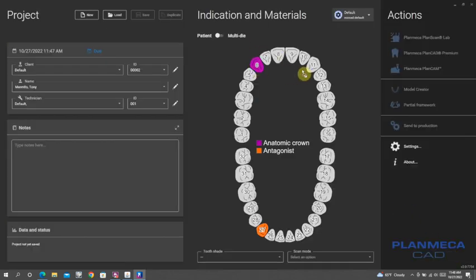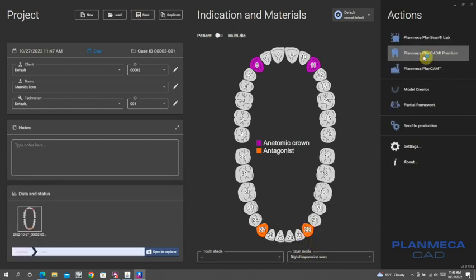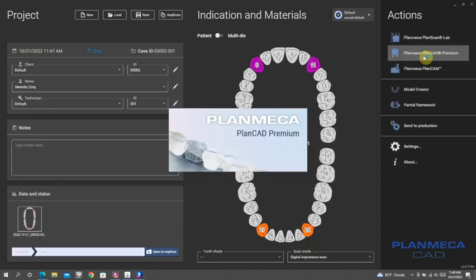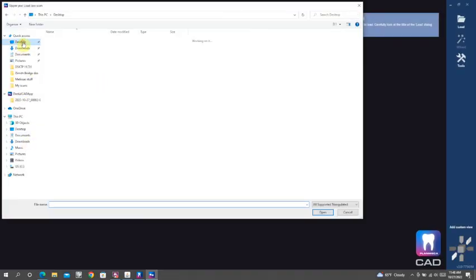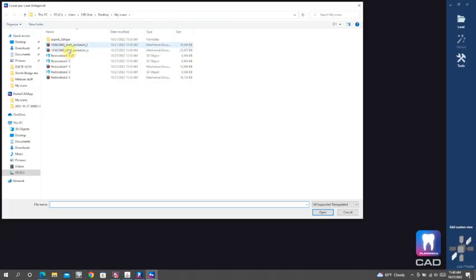A couple of small things that I'll point out as we go through this regarding things like cement gap and what I call margin ramp.